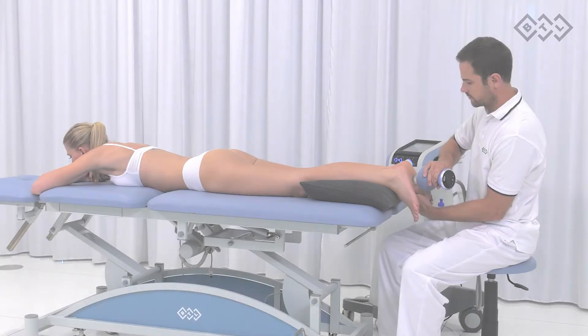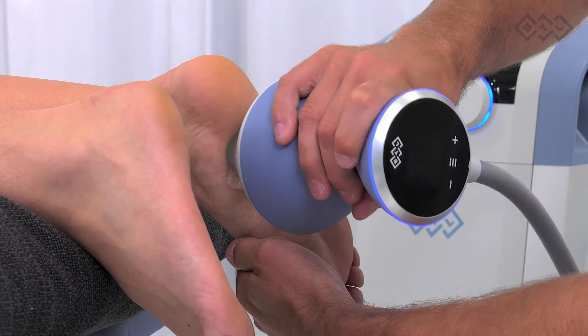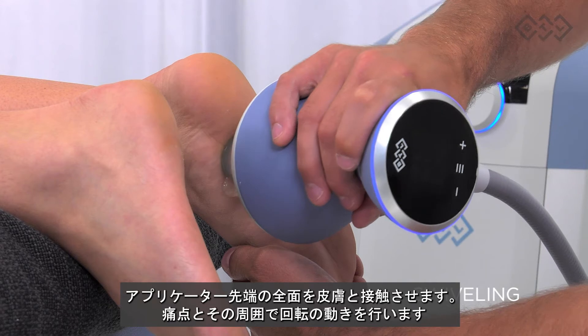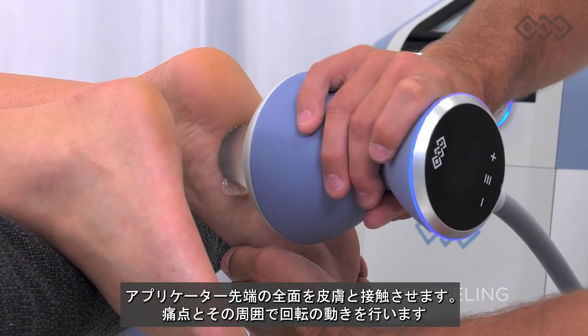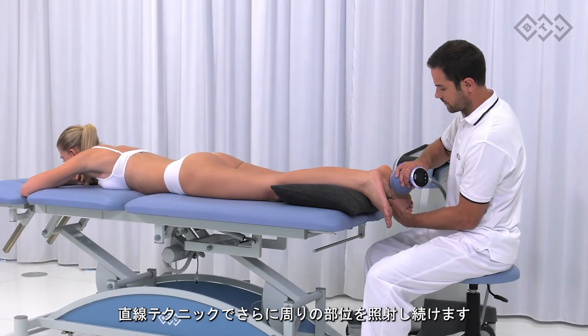Heel spur or plantar fasciitis. The tendon can be in a relaxed position or gently stretched but not in a painful position. Apply full contact therapy and perform swiveling movements in the most painful spot and its proximity. You can continue with the painting technique to treat the surrounding area.